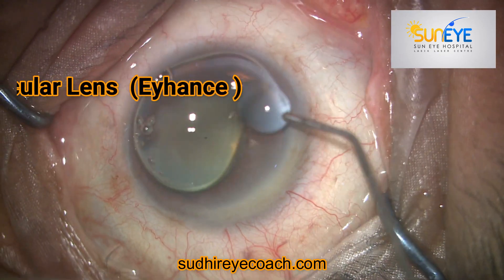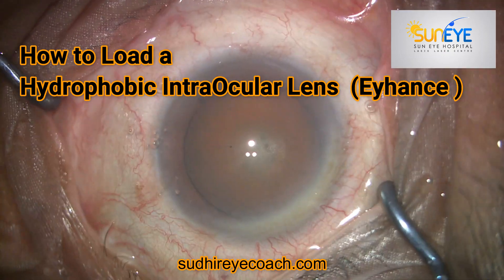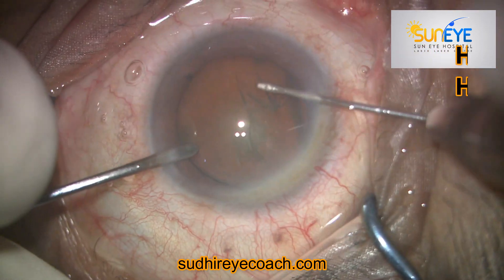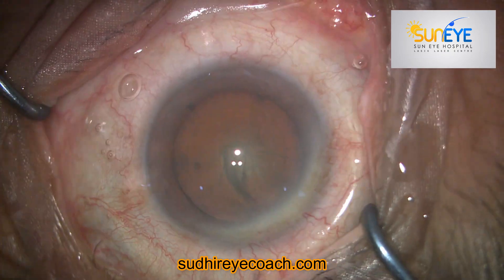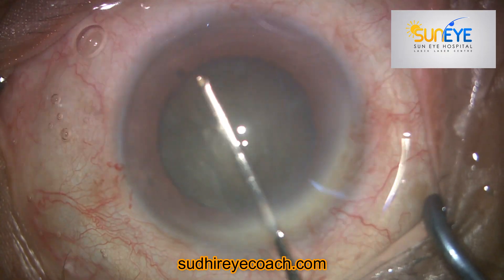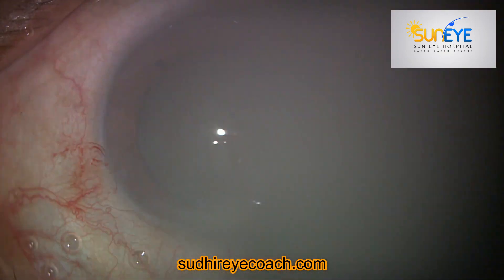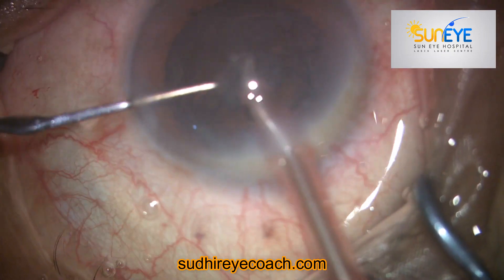Hello everyone, thanks for appreciating my videos. I got a lot of messages from my viewers and juniors about how to load an IOL. Today I will not be discussing any cataract technique, but I'll show you how to load a hydrophobic lens. I'll also discuss a new lens recently introduced by Johnson & Johnson called Eyhance, which is a monofocal type of lens.